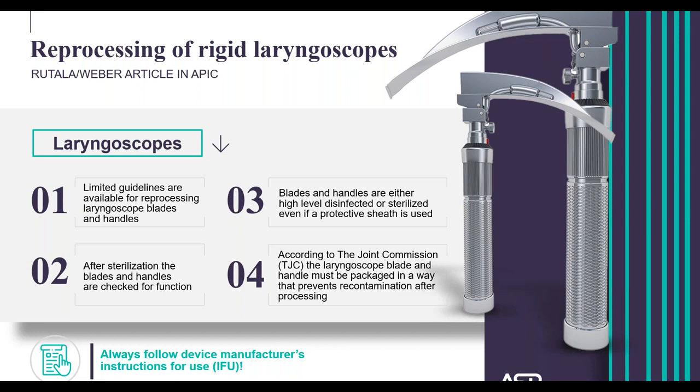Another point Rutala and Weber make is that although not all states require high-level disinfection or sterilization of laryngoscope handles, there have been reports of potentially infectious agents being left on what we consider or label ready-for-use handles. And those infectious agents include blood, Staph aureus, and Acinetobacter. And again, I think we only have to go back to Janet's previous comments about the NICU and the use of contaminated handles and blades and the consequences that occurred.